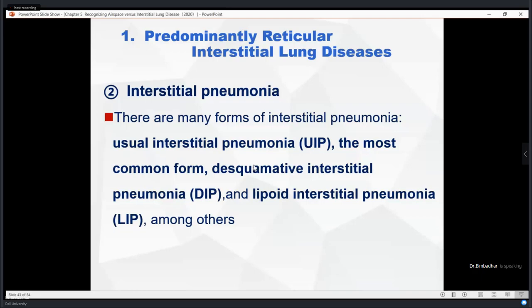And I can say most of the time, any kind of desquamative interstitial diseases, proliferative interstitial diseases, allergic, inflammatory diseases, eosinophilic granulomatosis, pneumoconiosis, Pneumocystis carinii, all such diseases generally present with a pattern called the interstitial pneumonic pattern. Okay, there are three patterns here.